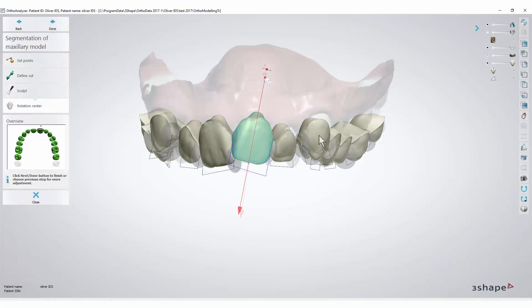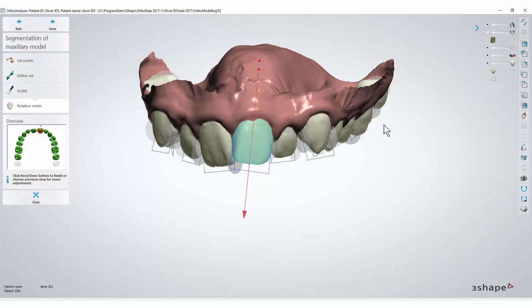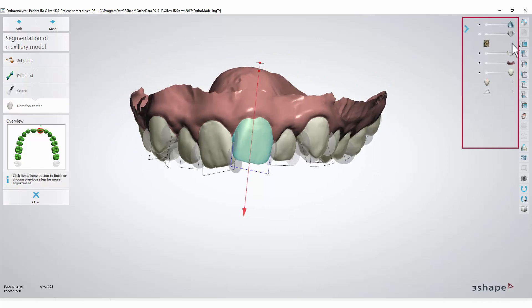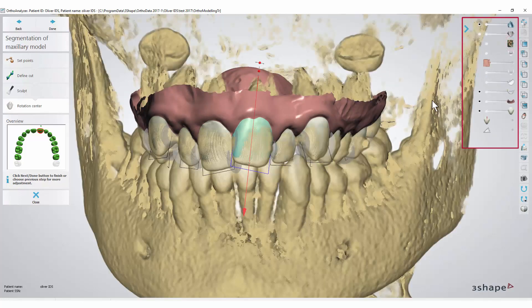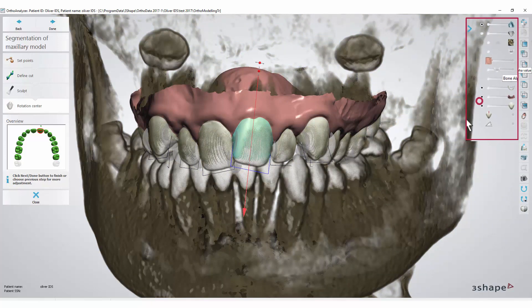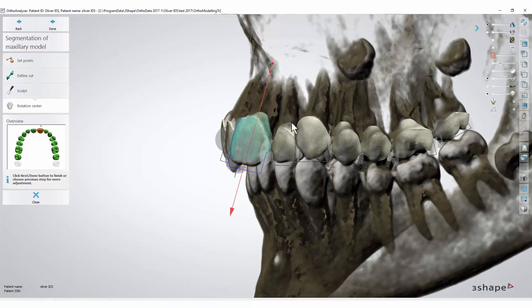In this step, you can set the Rotation Center at the height you want it to be — just grab the control point and move it. You can also make alterations to the axis direction angle. If you have imported and aligned a CT Scan, you can turn the CT Scan visibility on. Then use the slider to decrease the bone alpha value to add more contrast. Remove the gums, and now you will be able to see easily if you have placed the root rotation centers in the right positions.